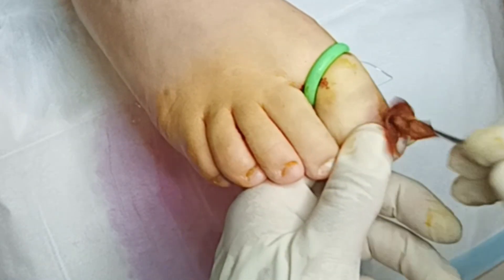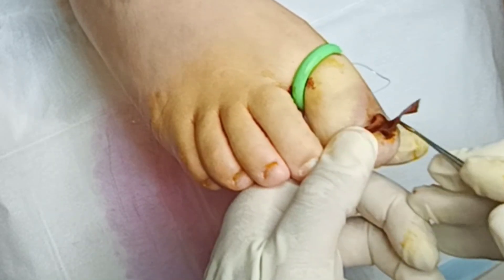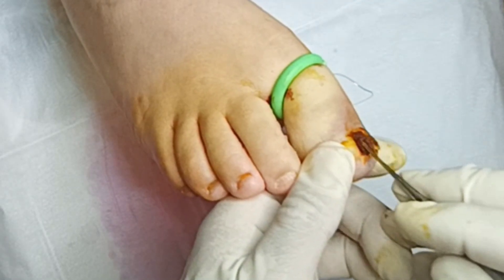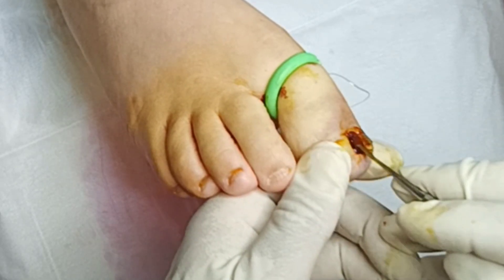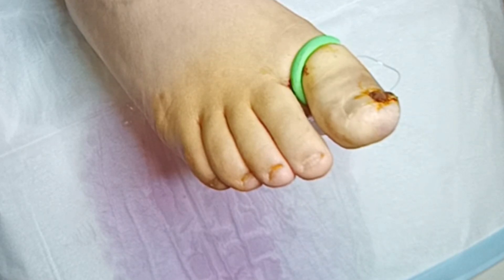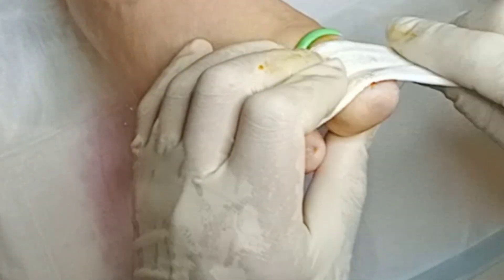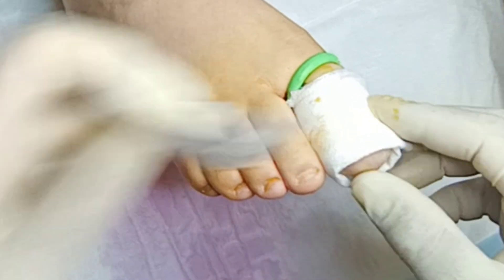This is what I mean with the betadine swab — it's packed in. Normally I cut it in half on an angle so I've got a nice small edge. I'll pack the small edge in first like a triangle and keep packing it in — you'll be surprised how easily it comes out. It's a nonstick material so you don't get granulation tissue building into it or anything like that. It's very good to use as a packing. So I'll pack that up nicely. The gauze is stretchy, so I'm not going to constrict the toe too much. Don't forget it is swollen because of the local anesthetic injection — as that subsides you're not at risk of making it too tight. The toe will reduce in size a little bit.